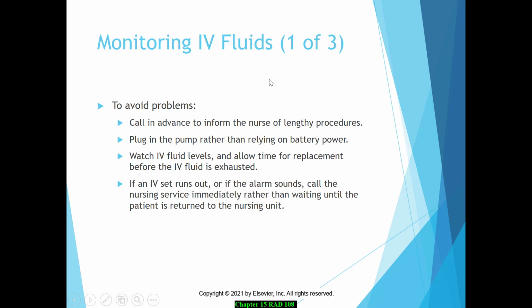To avoid any problems, again, if you are having a really difficult time starting your butterfly needle, CT and Nuke Med Techs are great because they do these all day long. One of the things that I'll encourage you on is if it's by the third poke and you can't get it, you need to find someone else to come in and start that for you. So you may need to go across the hall and grab the Nuke Med Tech and have them come start it. Again, if you're at a hospital where you have a nurse that does these, then it's great. But if it's up to you to do it, then you do want to get to know some of the other people in the departments that are pretty good at starting these IVs.